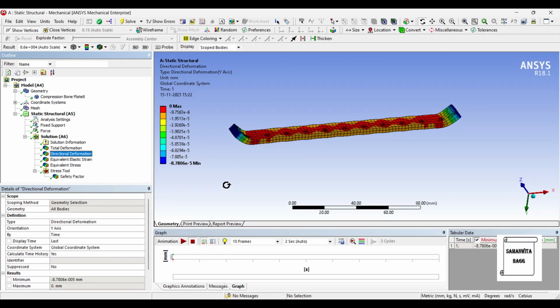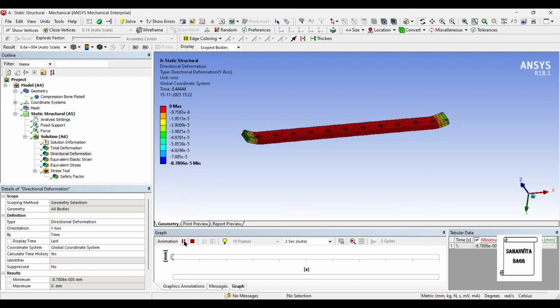Next, we'll see the directional deformation. The value is minus 9.75 into 10 raised to minus 6 mm. Again, this is a very small value of deformation obtained. You can just animate and check the result.